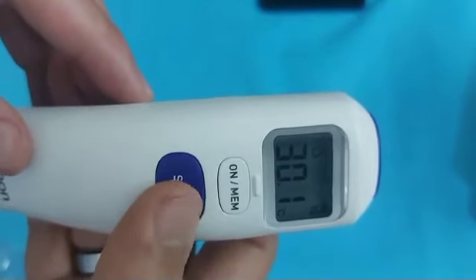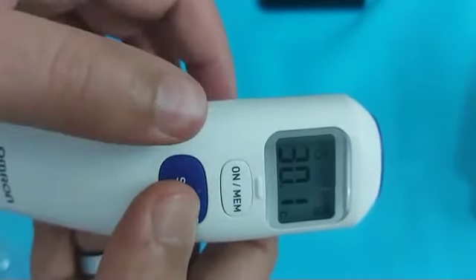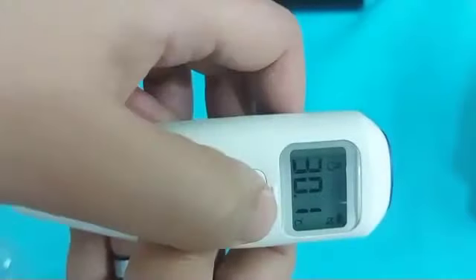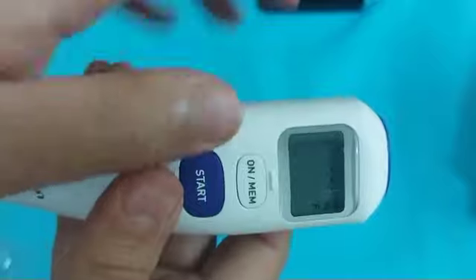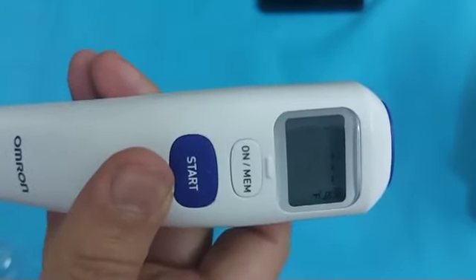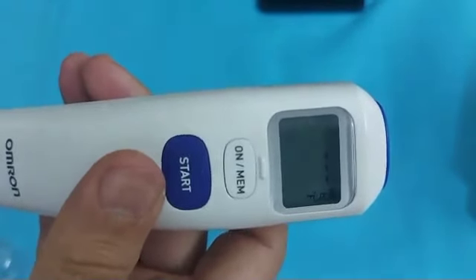To change Celsius to Fahrenheit, turn off the thermometer or change into room temperature mode and press the Start and Memory button simultaneously. The Celsius mode will be changed to Fahrenheit and the letter F will appear on the screen.